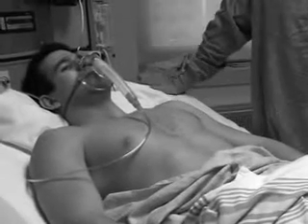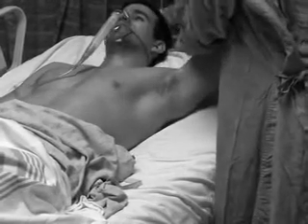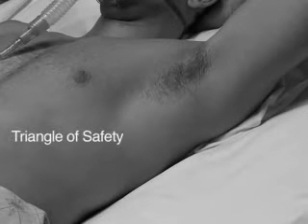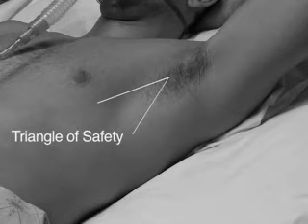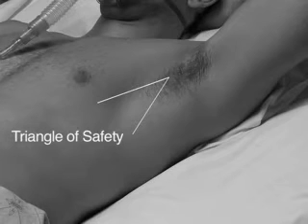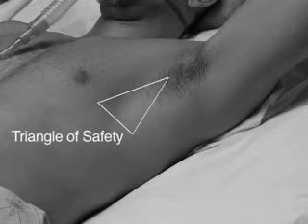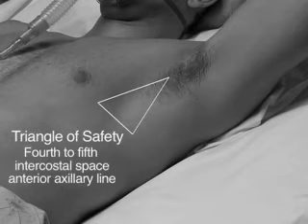The patient should be positioned either supine or in the semi-recumbent position. The ipsilateral arm may be maximally abducted to the side of the patient, or alternatively positioned behind the patient's head, in order to have optimal exposure of the insertion site. The ideal location for the placement of a chest tube is in the triangle of safety, the anatomical region defined by the lateral border of the pectoralis major muscle anteriorly, the mid-axillary line posteriorly, which is also the anterior aspect of the latissimus dorsi, the apex just below the axilla, and the horizontal level of the nipple inferiorly. The nipple line may be an unreliable landmark for female patients due to breast tissue. The triangle of safety should approximately lie between the fourth and fifth intercostal space in the anterior axillary line.